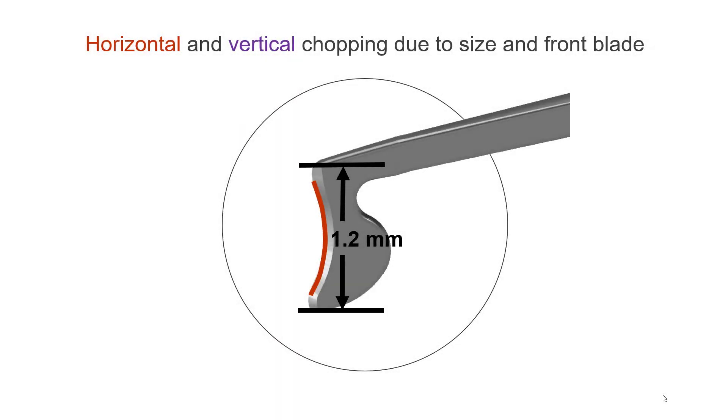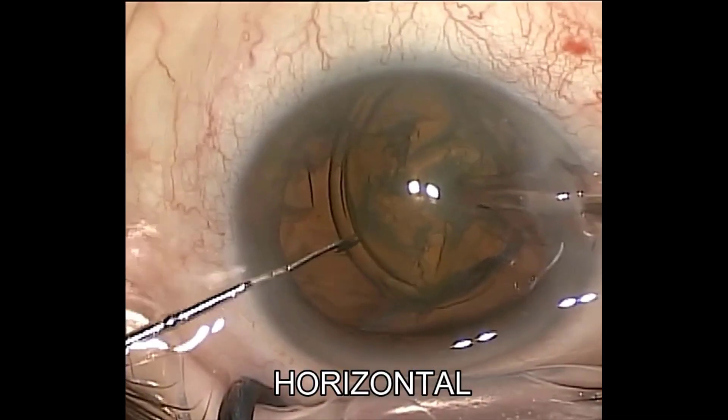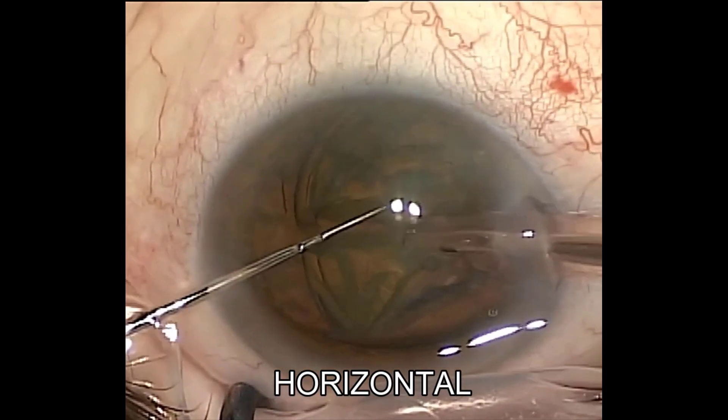The delicate tip with a curved blade of 1.2 mm height at its distal end allows not only for horizontal but also for vertical chopping techniques. Here are some examples of horizontal and vertical chopping with a Jakubowicz chopper in one hand and a FACO tip in the other.